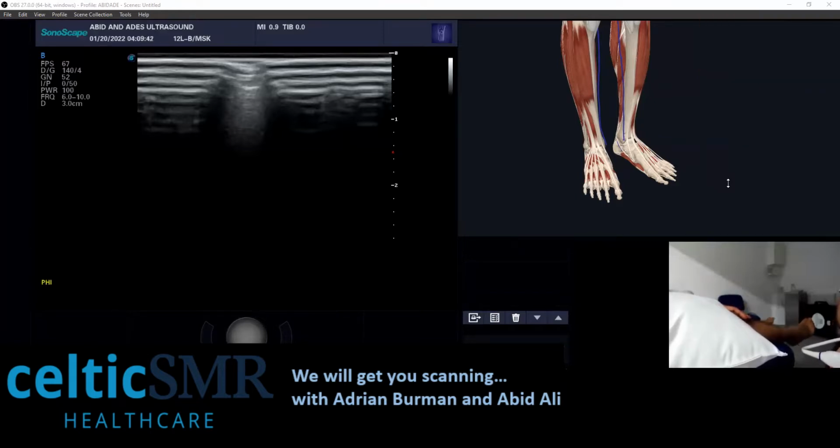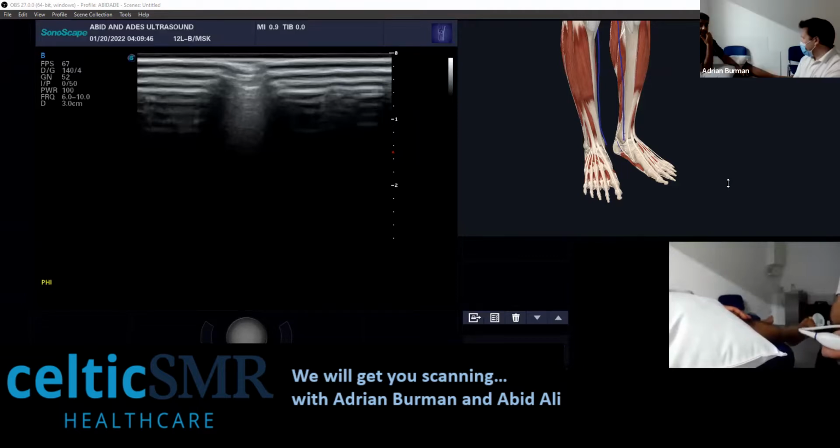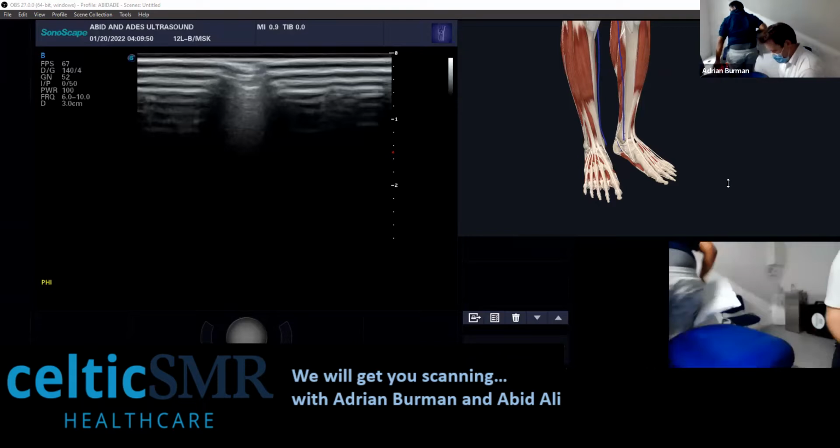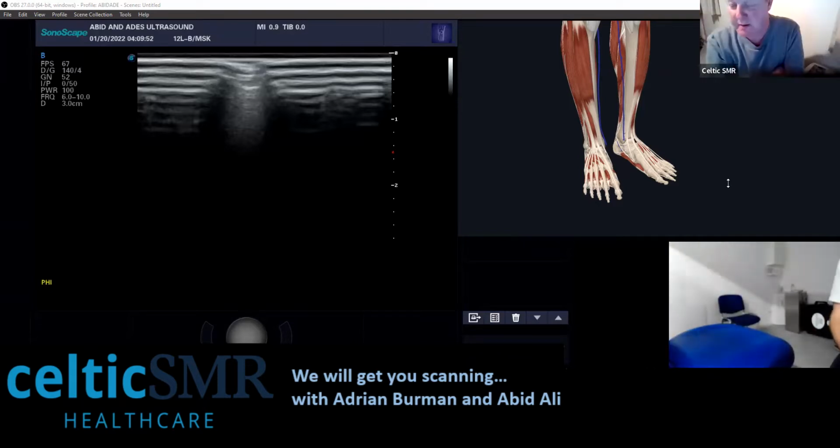Popliteal fossa, do you routinely do that for that as well, or is that not? Yeah, I can look at that. I'm easy to learn with. We've had a second to that, so that'd be great.